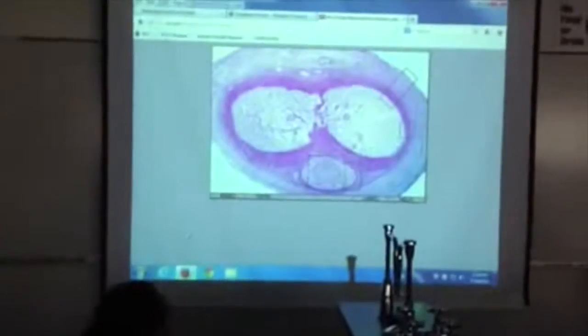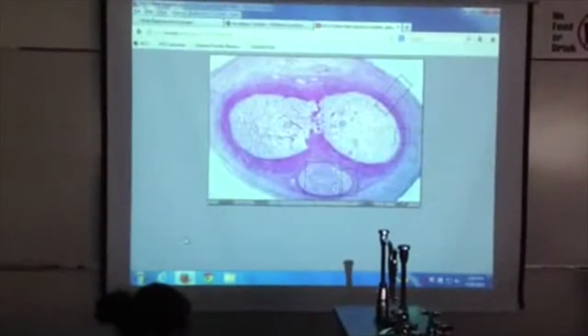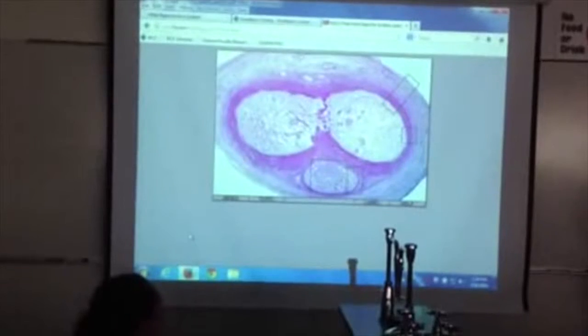Now, unfortunately, JDoc does a crummy penis. That comes out wrong, I know. I'm going to get you a different penis here. Hold on. Classic penis.